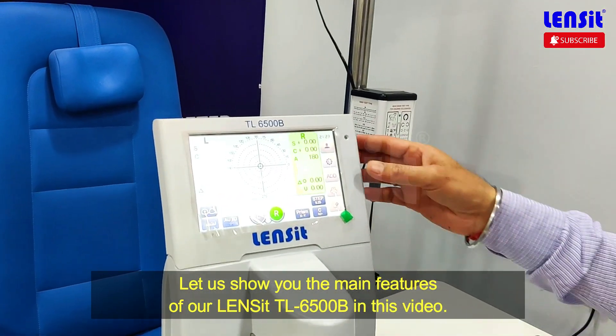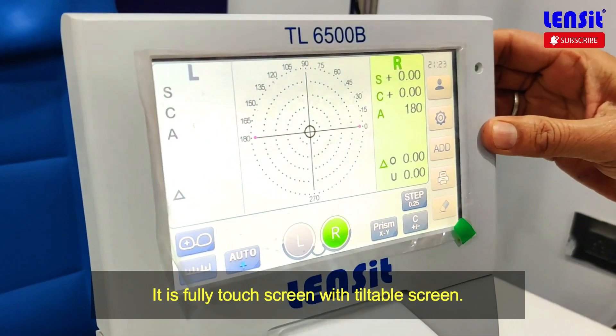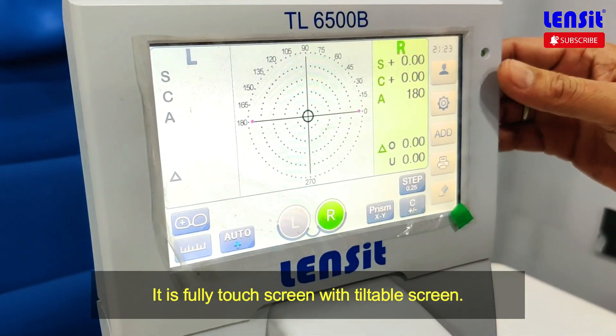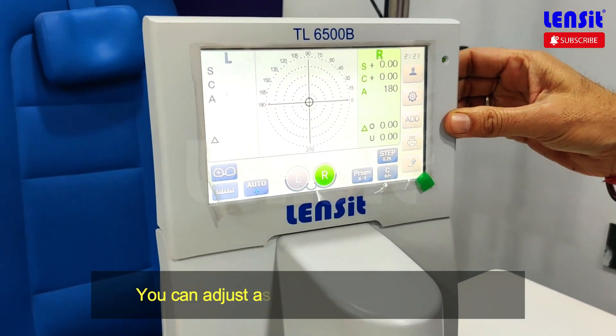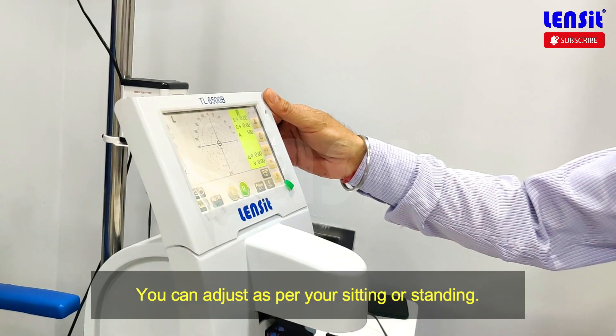What are the features? This is a tiltable screen and a touch screen. If you are standing and need to adjust the screen, you can adjust the screen.